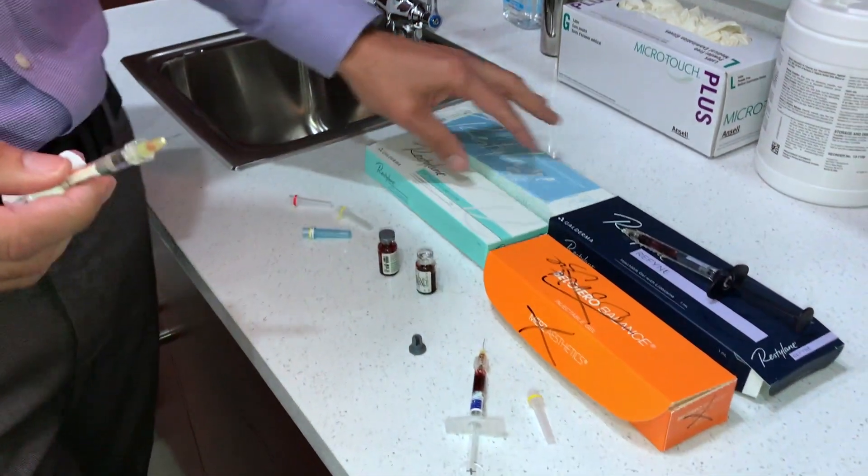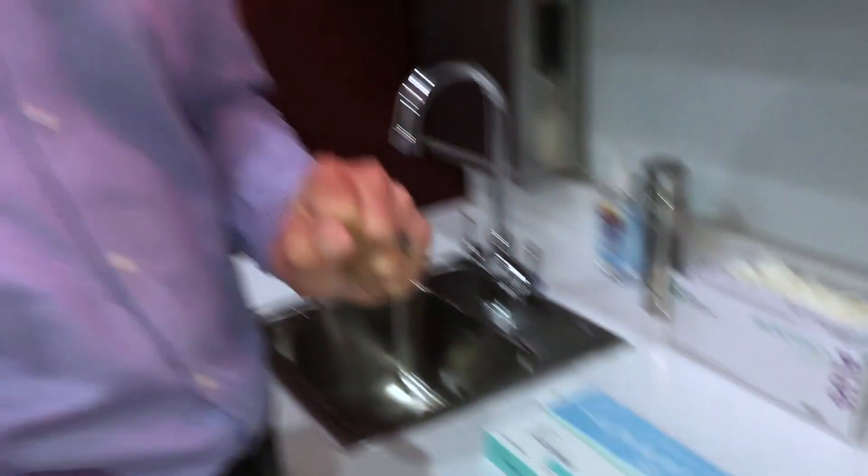That's a positive for the Galderma products — aspiration does work with them. I don't have any of the Allergan products on hand, but if they want to send them to me, I'll do this test with them too. So myth busters — I didn't bust the myth. Aspiration does work for the Galderma products, at least for Refine, Lift, and Silk.